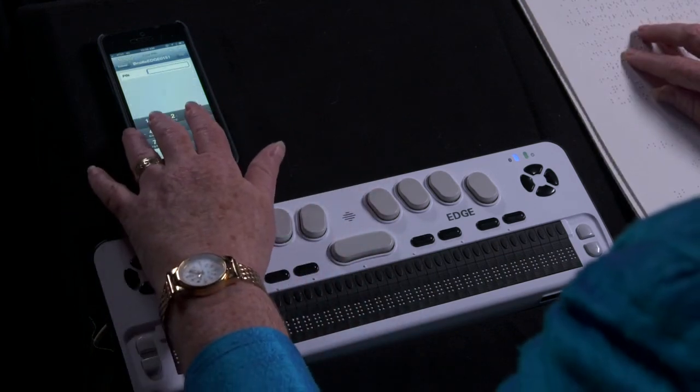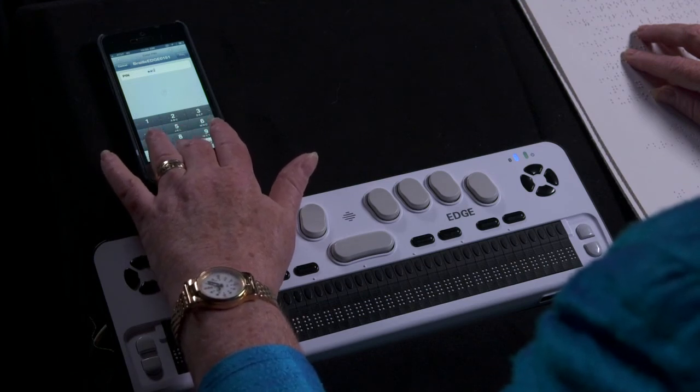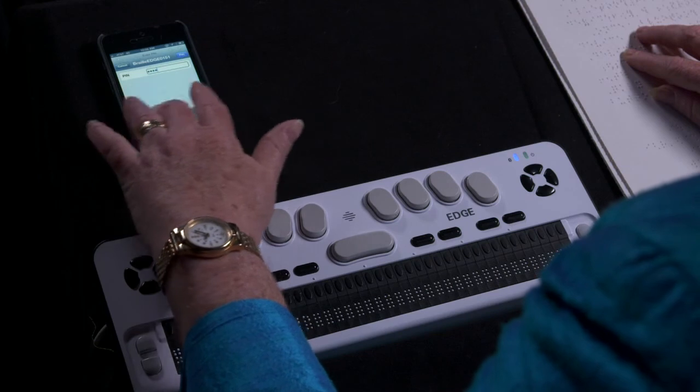Quickly enter the code and select the Pair button. The PIN secure text field is shown. Entering the four-digit code 0000, then selecting the Pair button.